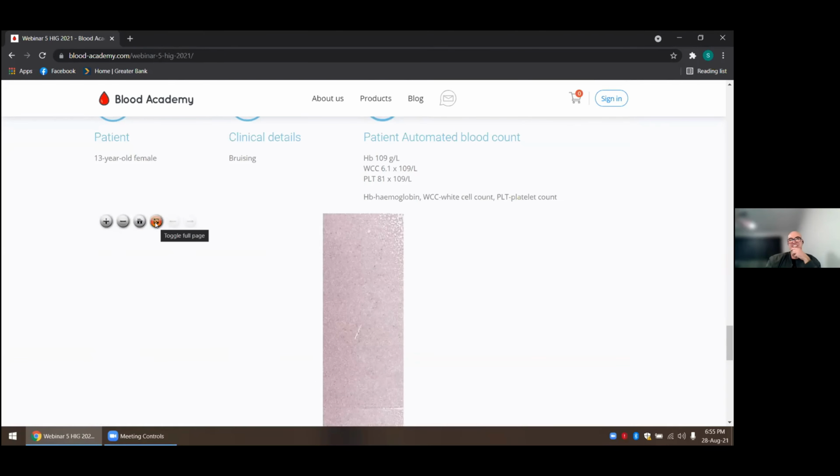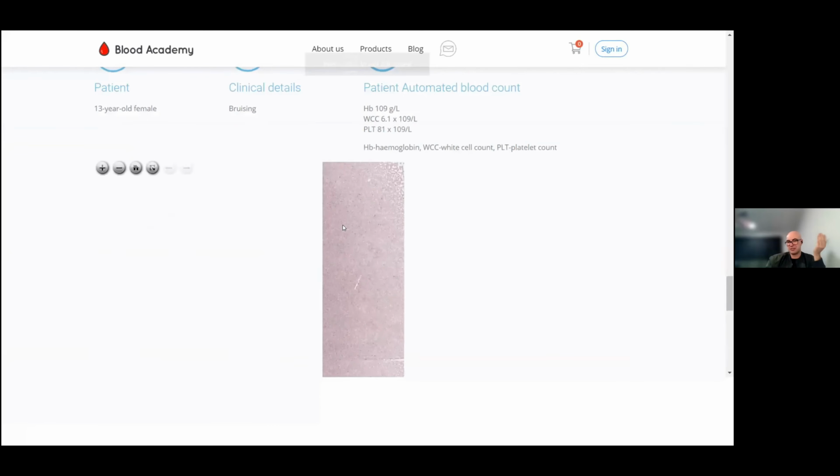Okay, no worries. Just like with the other ones, the first thing you want to determine is whether the platelet count is accurate or not. Is the sample clotted? Is it platelet clumping? Is it platelet satellitism? So I'm sure you're all getting the gist of it by now.